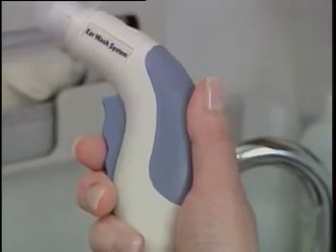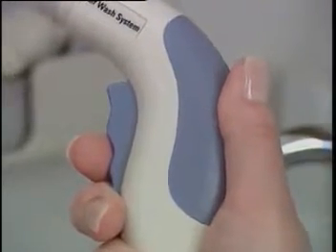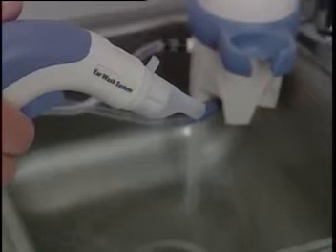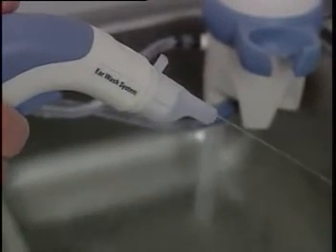Water flow is regulated by the actuator on the handle. When the actuator isn't pressed, only the suction is activated. Pressing on the actuator introduces water into the ear so that you have both water and suction.